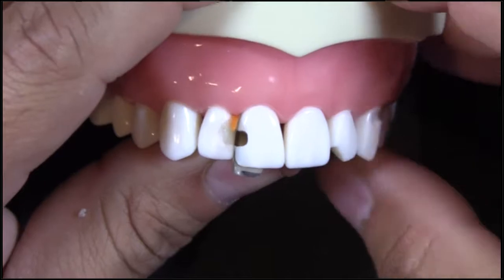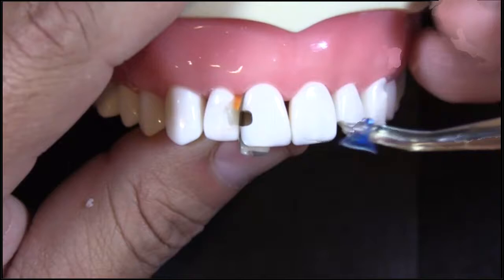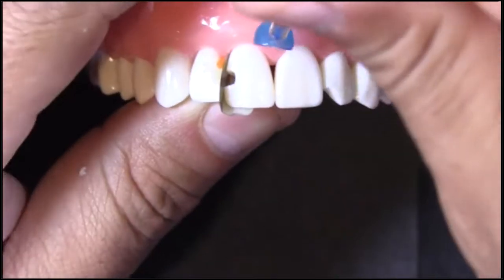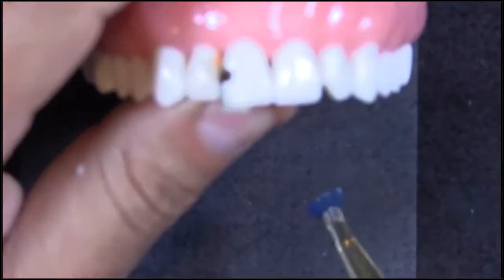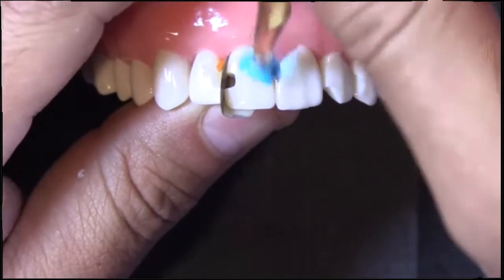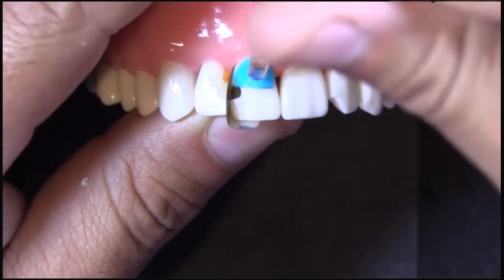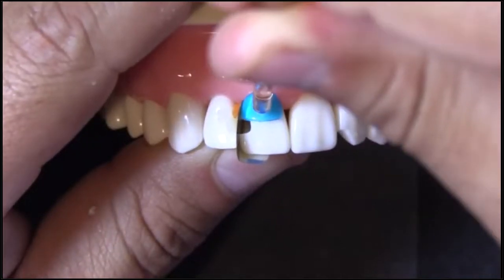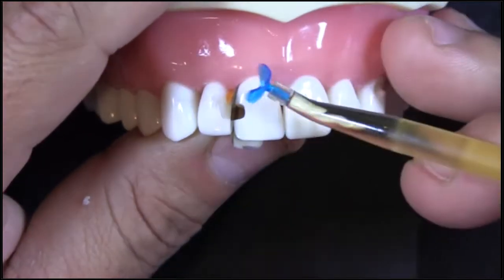The other thing we could do, I think I showed that in a clip, is if we had a class 5 combination with this, we can use this tool. This is the Blue View cervical matrix stamp. We can use that, it guides right up against that. See if I can find the angle to show you guys. It guides right up against that matrix band, and we can press that down, compress that composite, end up with a really nice result, and just kind of use that as a guide.